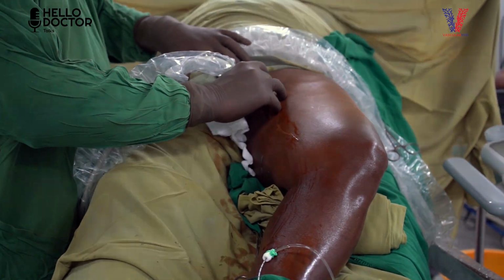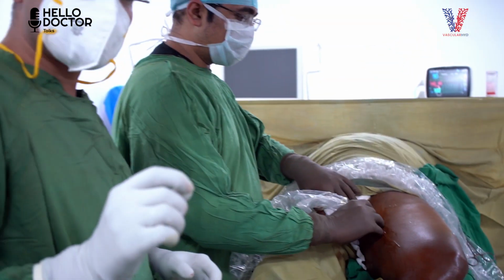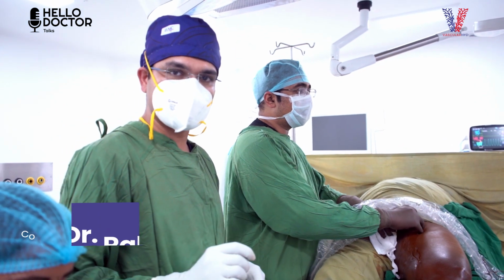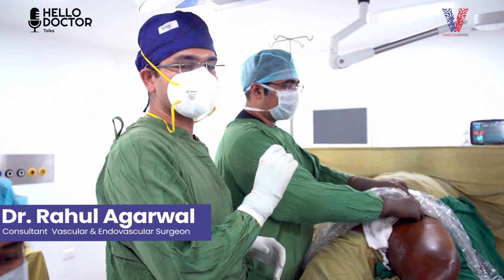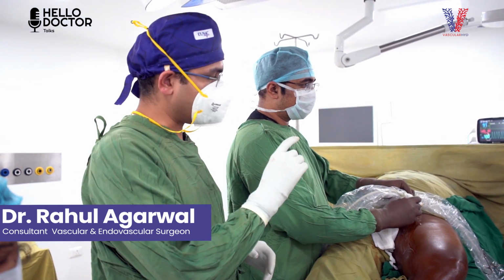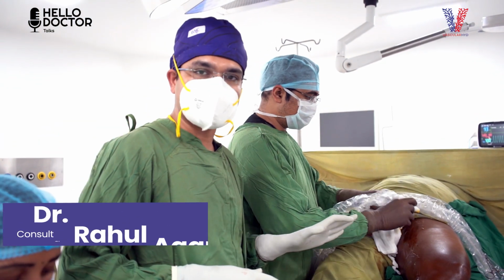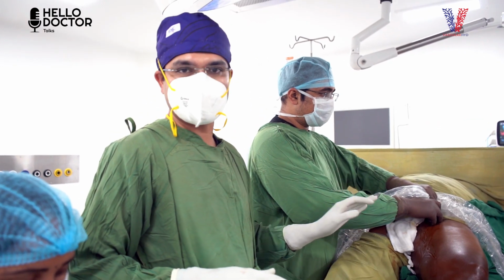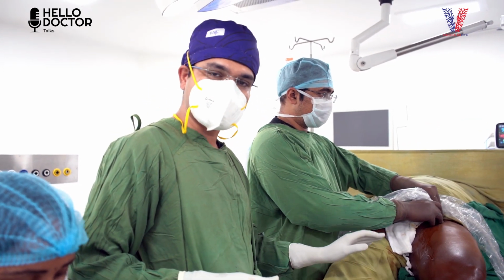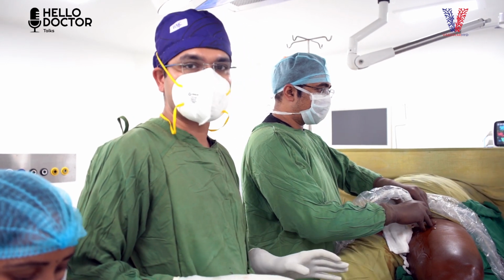Now, to double confirm that the tip of the fiber is in the actual vein that we are treating, and to see the position of the fiber tip at the junction, we have to use ultrasound. Without ultrasound, going blindly for this positioning of the fiber and the tip is not recommended.